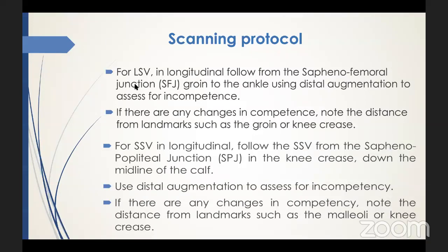And then the long saphenous vein has to be assessed with the saphenofemoral junction, and the short saphenous vein has to be assessed with the saphenopopliteal junction. Any dilated or reflux perforators have also to be mentioned within your report using the diameter measurement and the flow direction within the vessels and the perforators.